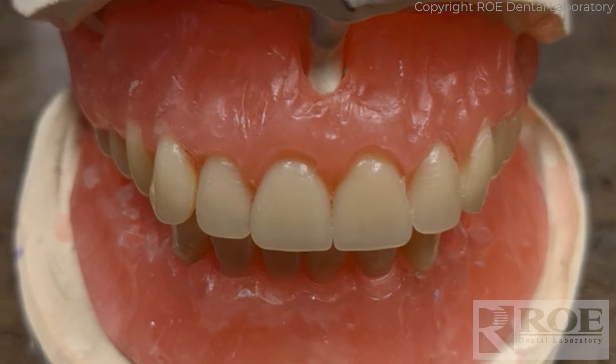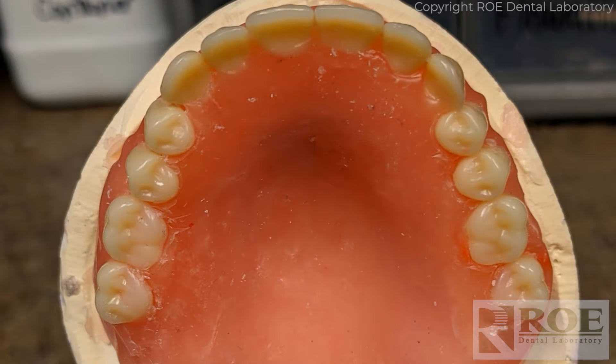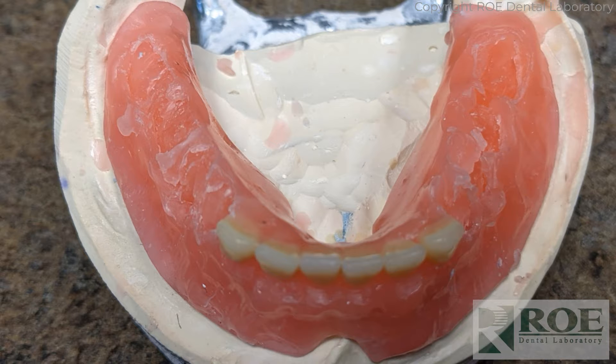The patient has an existing denture, but the doctor had a local laboratory complete a setup for an upper and a lower. Today is going to be surgery just on the lower, then deliver a denture. The prosthetics did not get fabricated to completion, so instead we're working with some wax ups and a little different creative prosthetic that I'll show you in just a second.